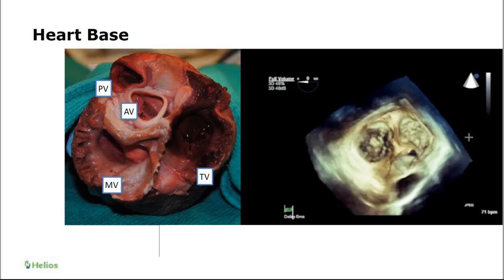And when the surgeons open the aorta and look in, what comes at the top? We all know, as cardiac anesthesiologists, very well that the top is the right coronary cusp. And that's where the air would go at the end of the cardiopulmonary bypass if we don't de-air the heart properly. But then if you look at the guidelines, the way the aortic valve is supposed to be displayed is actually upside down.